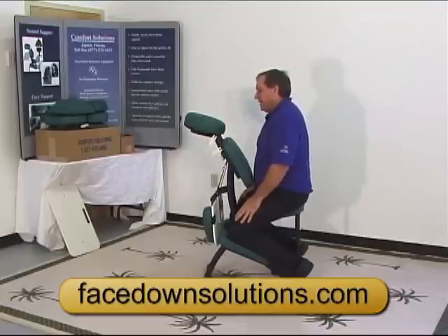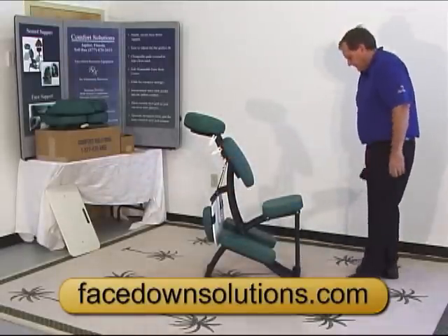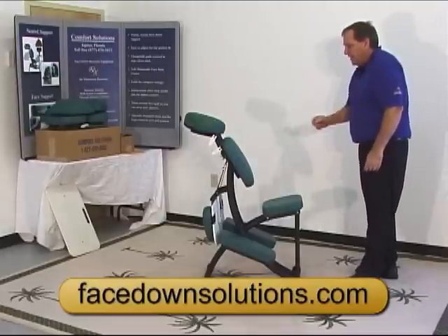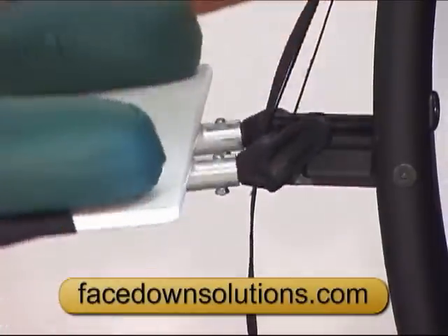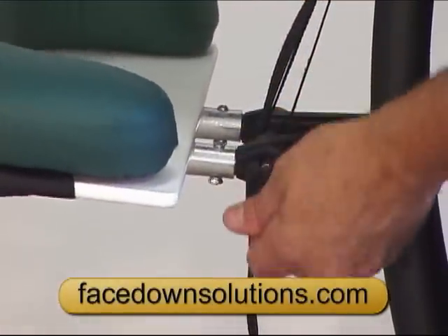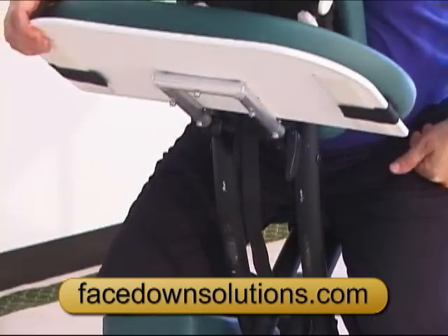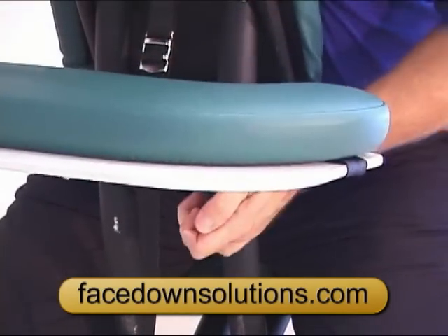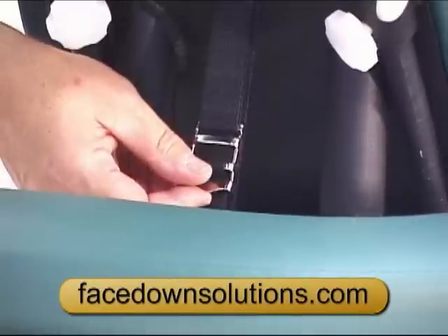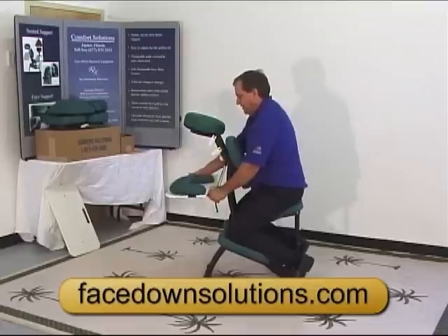When you get out of the chair, don't push on the tray table — use the chest cushion to get up. If you want to use the tray table, simply lift it up and lock it into position with the cam lock. To raise it, lift it up and pull on the strap and adjust the angle. If you want to lower it, lift up on the buckle, lower the tray table, and again adjust the angle.